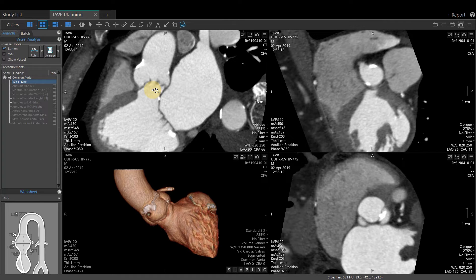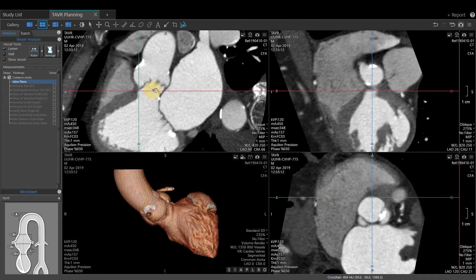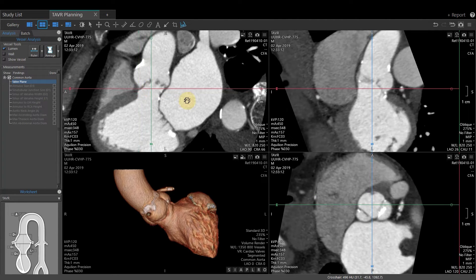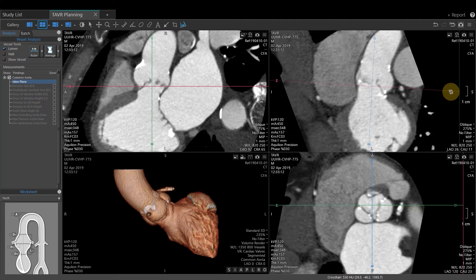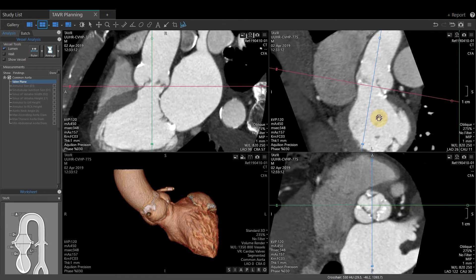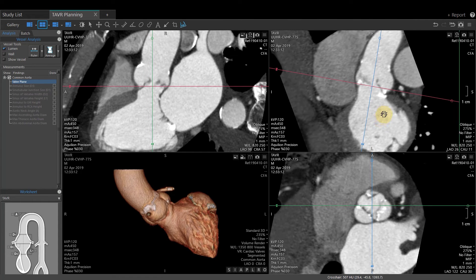To display a crosshair reference line, hold down the left ALT key. When you keep the left ALT key down, you can click and drag the crosshair around as needed, oblique as needed, and scroll through the images as needed.